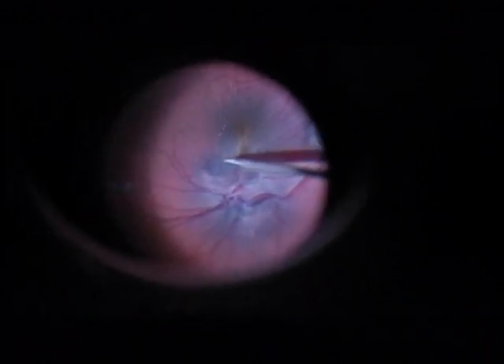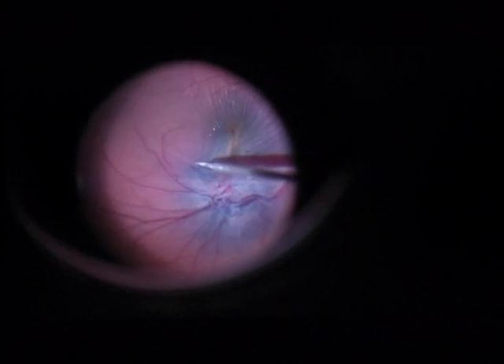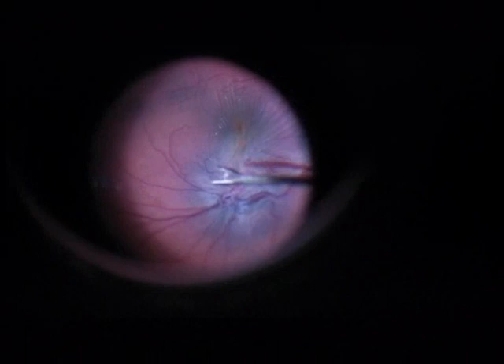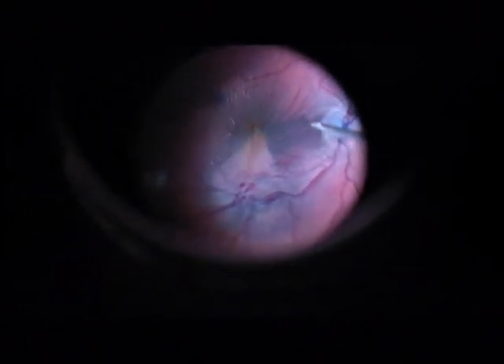The next step is an ILM peeling around the macula. I don't know if this is really necessary, but the ILM is already open at the superior arcade, so I'll just continue to make a peeling around the macula.